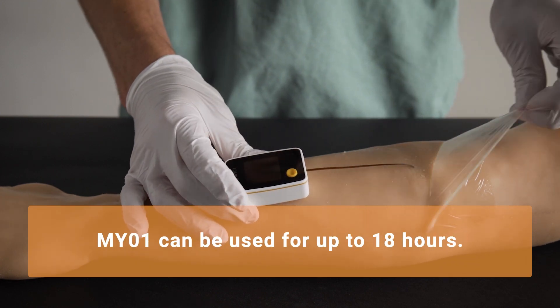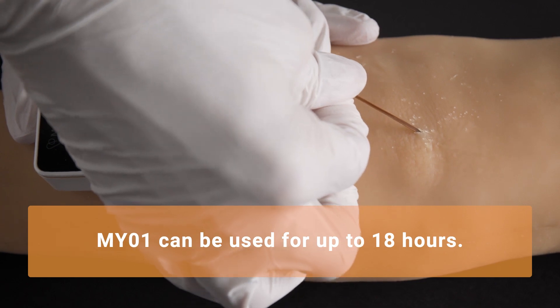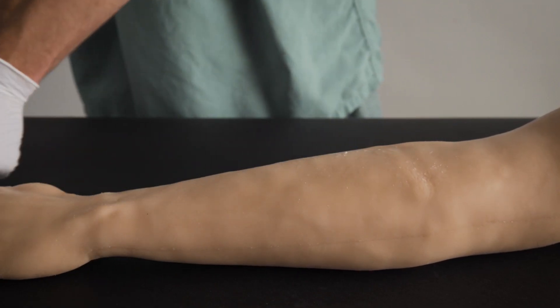After the monitoring period has ended, remove the medical dressing and remove the lead wire, similarly to how you'd remove an IV line. The device can now be disposed of according to your facility's biohazard guidelines.